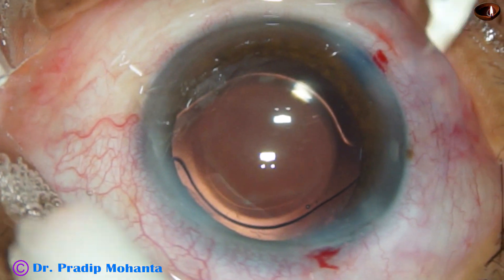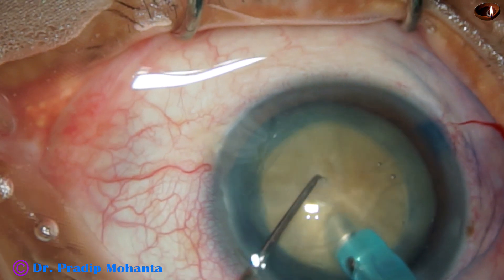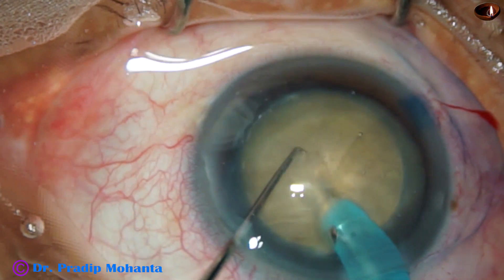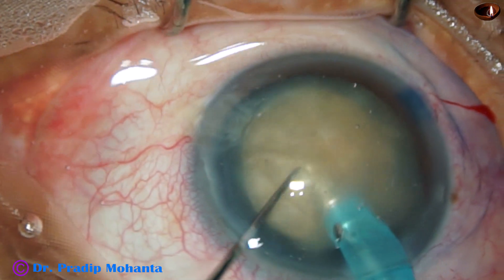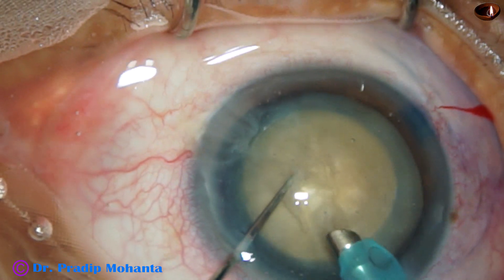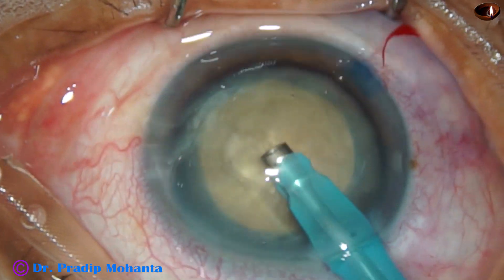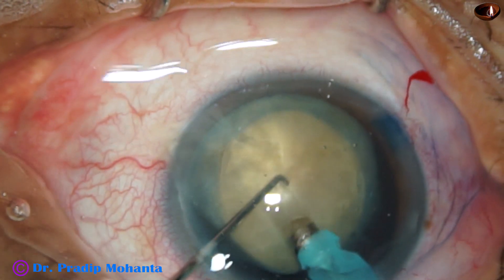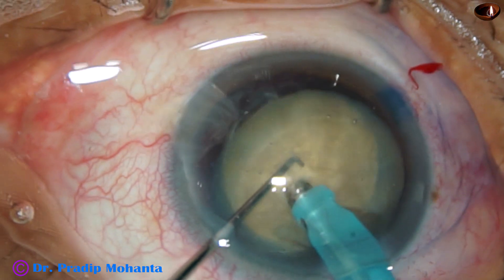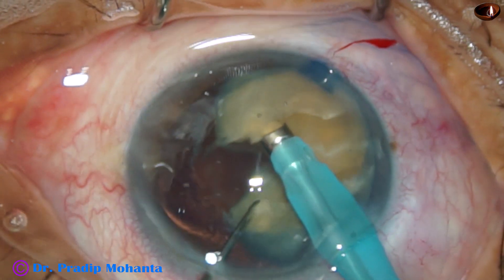Thank you very much for your attention. Hope this video will help you in managing your cases with hypermature Morgagnian cataracts. Always remember that you cannot engage the phaco needle with bevel up because the nucleus is free-floating. We have to engage the phaco needle with bevel down, make a tunnel, and then we can use the phaco needle with its bevel up.